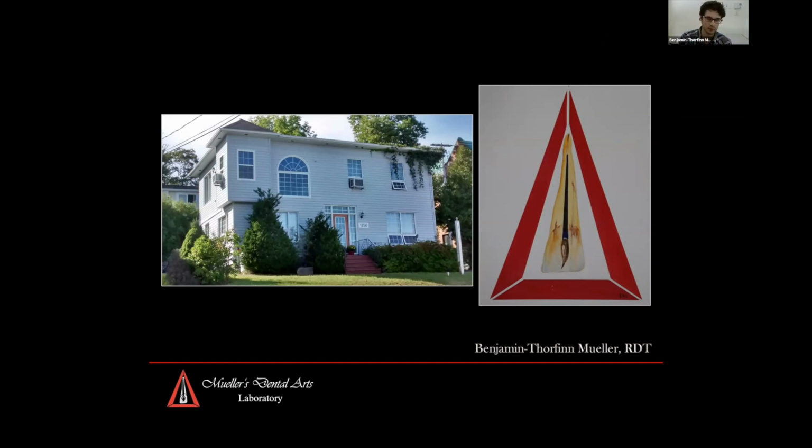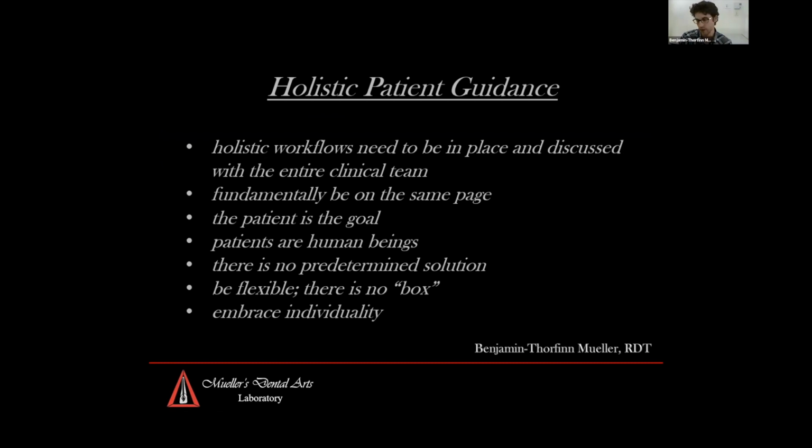Main thing being, make sure that you have done your homework and that you've practiced on smaller cases. Because the worst thing is that you dive into these things cold turkey and don't know what you're getting into. So one of the biggest things for us, in the workflows that we have developed, is holistic patient guidance. These workflows need to be in place and discussed with the entire clinical team prior to you even attempting a case. That doesn't mean that you only talk to the treating dentist, but you also have a meeting, in regards to the nitty-gritty of the cases or of the workflows, with the assistant and the admin staff of the dental office.